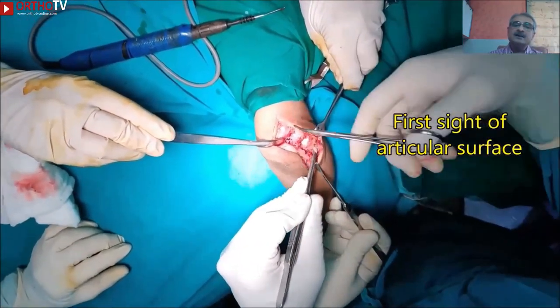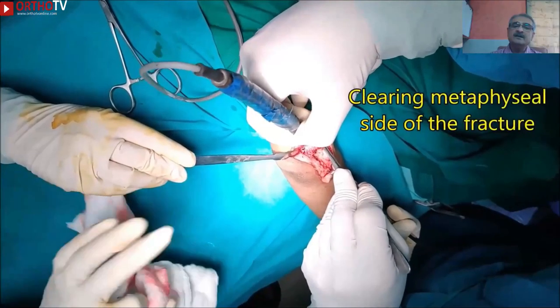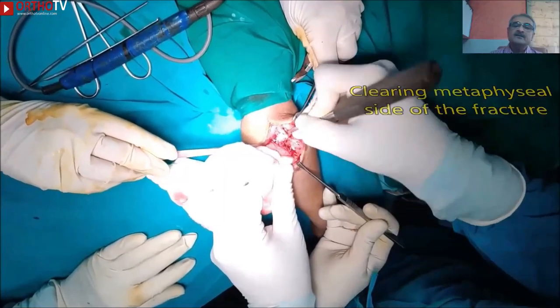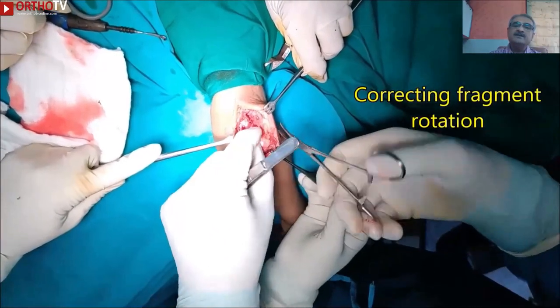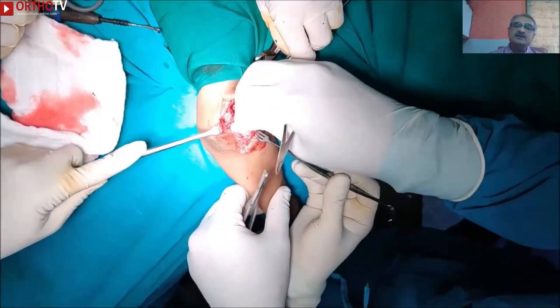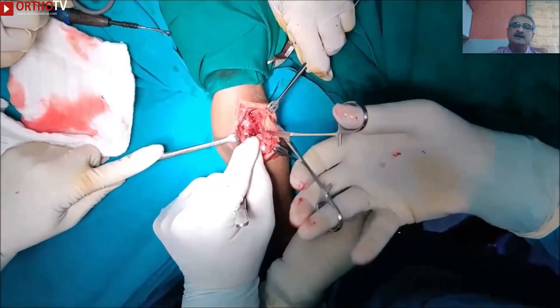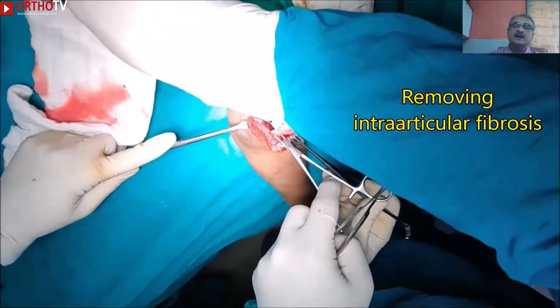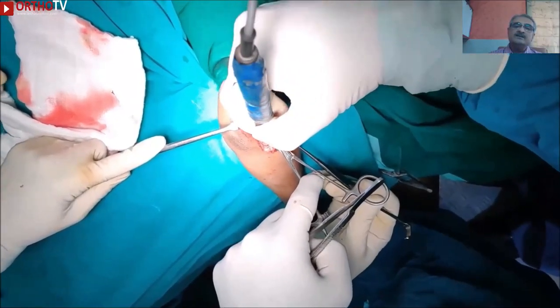Once that is done, blunt dissection between the metaphyseal side of the fracture and the rotated fragment is performed using a hemostat and a cautery forceps. To achieve better alignment, it is a good idea to separate the metaphyseal fragment on both the anterior and posterior sides. The rotated and flipped fragment is then corrected. If manual correction is not possible in a late-presenting case, some soft tissue dissection between the lateral condyle and capitellum may be required. Any intraarticular fibrosis at this stage should also be removed.